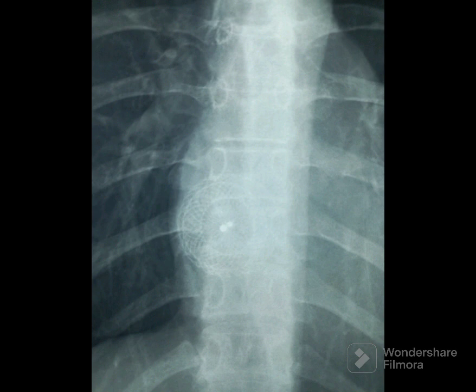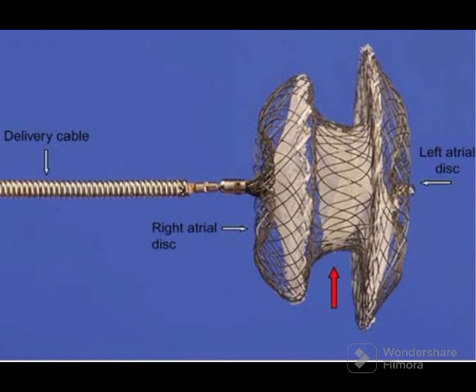It is an ASD closure device used for atrial septal defect. The actual device has two discs — one for the right atrium and another for the left atrium.